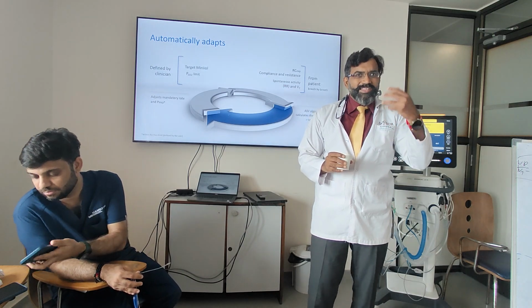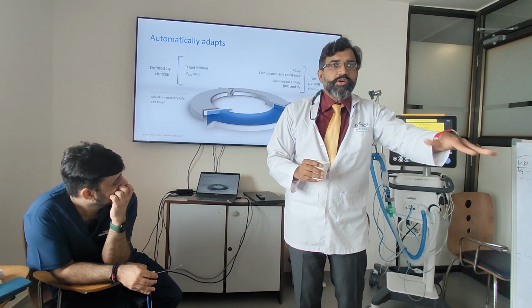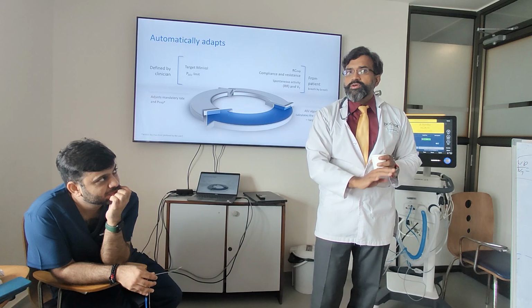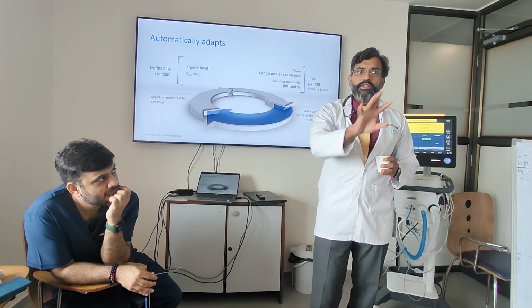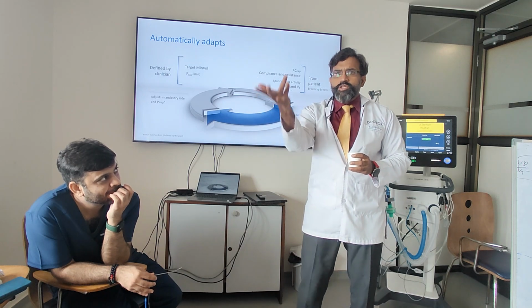You understand? So basically it is doing things so that it does not destroy the lung. Otherwise what will happen? Say the patient is in volume control. You are not around, and the RR is 40. You are doing some other work. There is no alarm ringing, so the nurse also doesn't look at it.